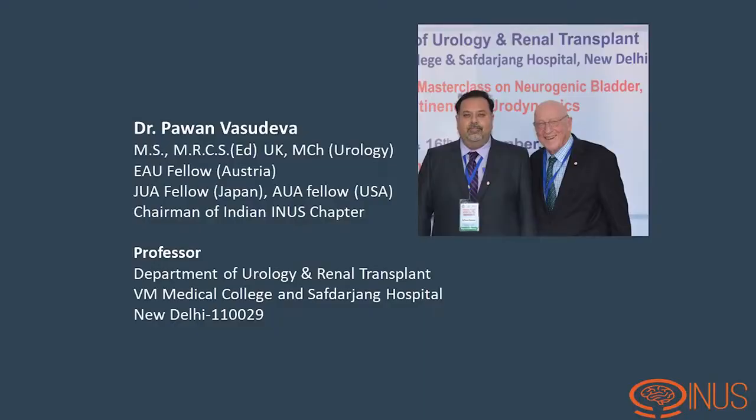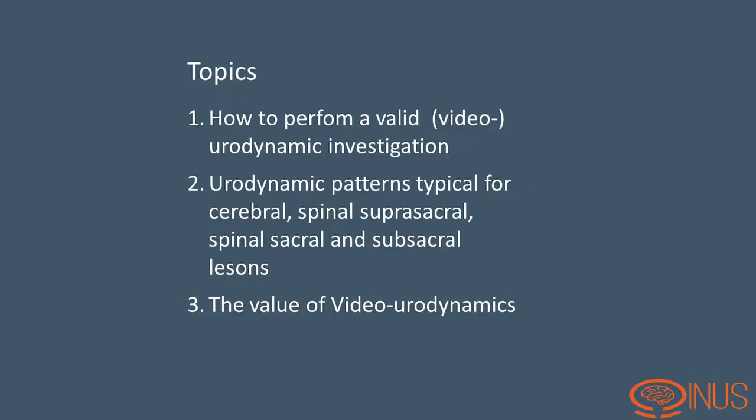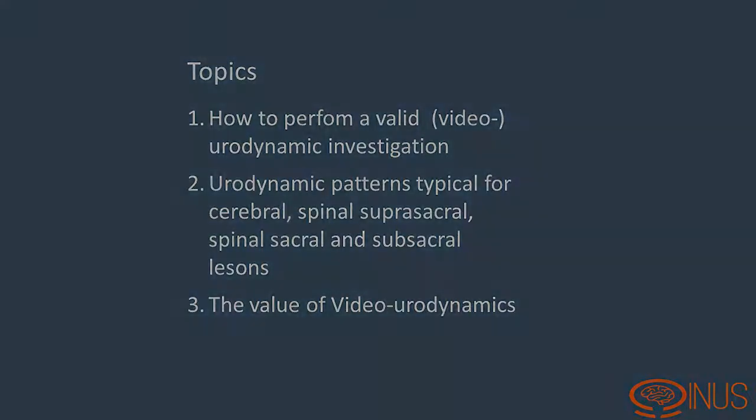Together with Thomas Kessler and our Indian friend, Professor Pawan Vasudeva, head of the Department of Urology and Renal Transplant in the VM Medical College and Safdarjung Hospital in New Delhi, in this video we will present to you the following topics. Firstly, how to perform a valid video urodynamic investigation. Secondly, urodynamic patterns typically for cerebral, spinal suprasacral, spinal sacral, and subsacral lesions. And thirdly, video urodynamics can detect risk factors in time before irreversible damage occurs.